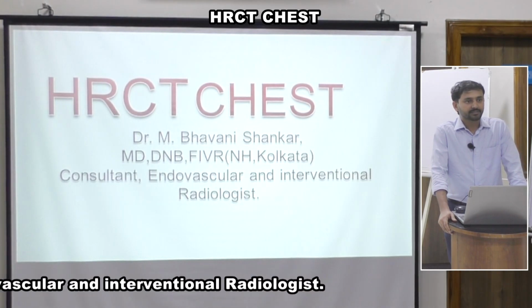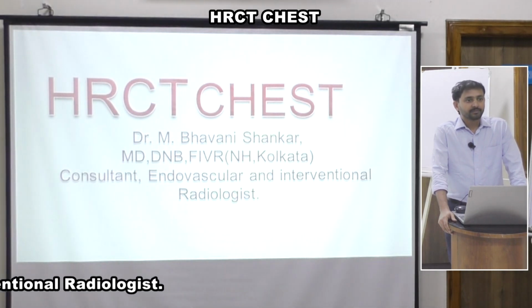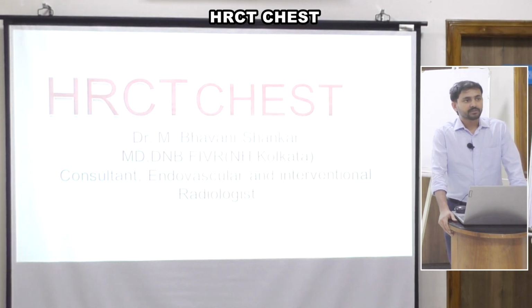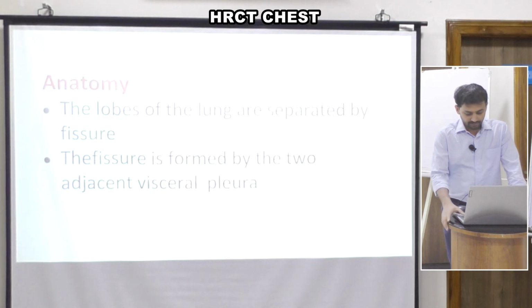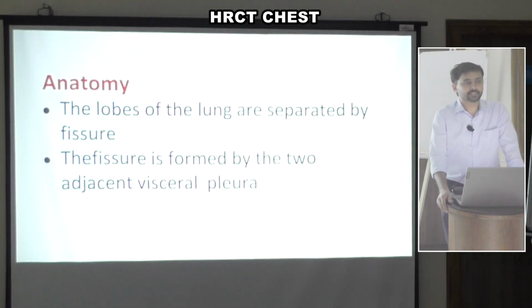Apart from radiologists, clinicians, particularly in emergency situations and for basic interpretation, what should they know? These are the points I am aiming to discuss. The topic of discussion is mainly basic anatomy and some disease patterns.